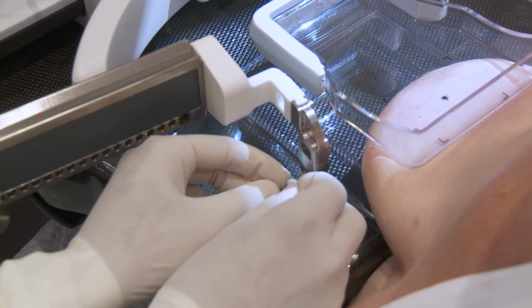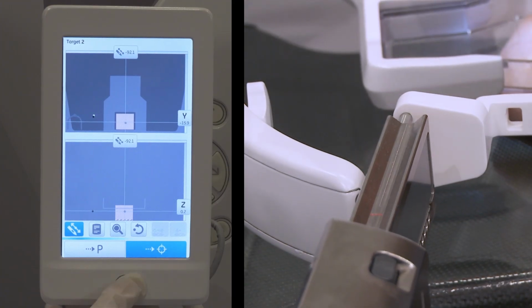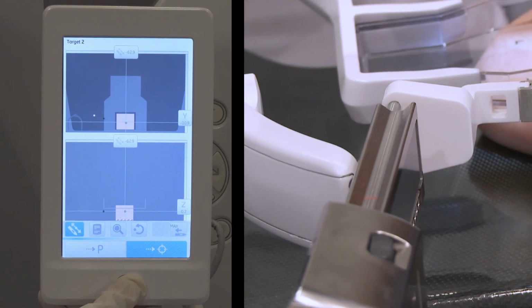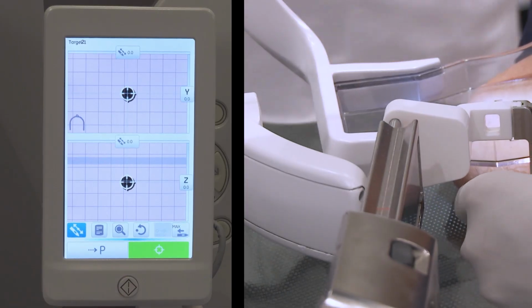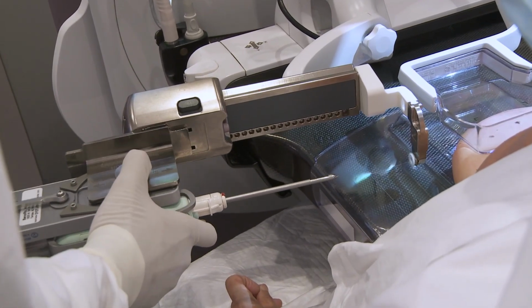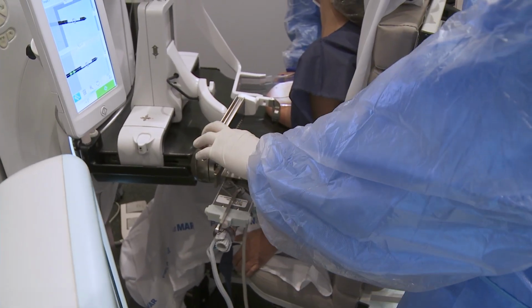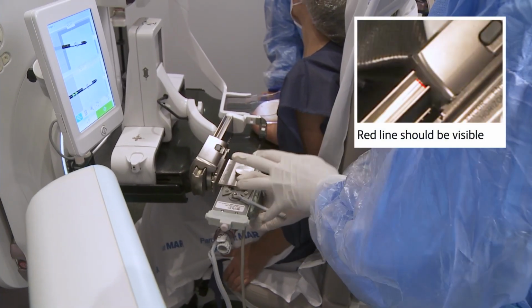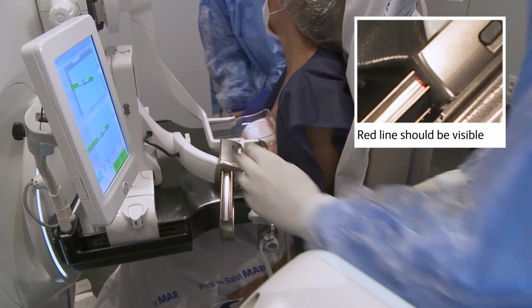Insert metal and plastic EnCor 10G needle guides. Touch Target button and go to New Target Coordinates. Attach the horizontal approach adapter with the EnCor device, ready in pre-fire position, to the biopsy head slider. The slider is driven manually all the way.